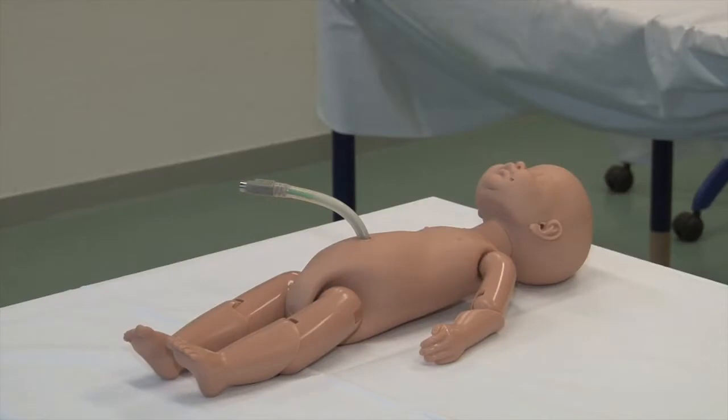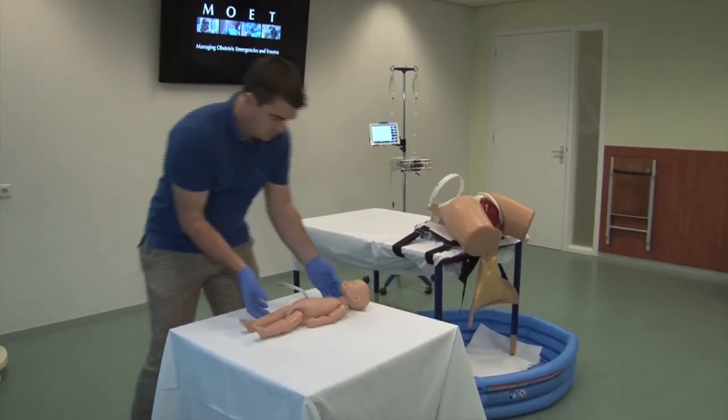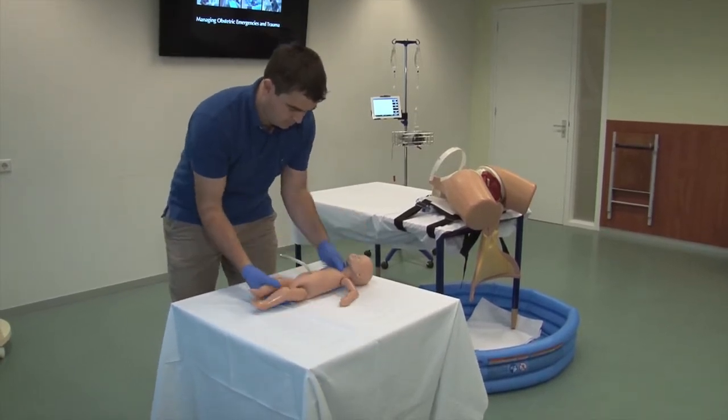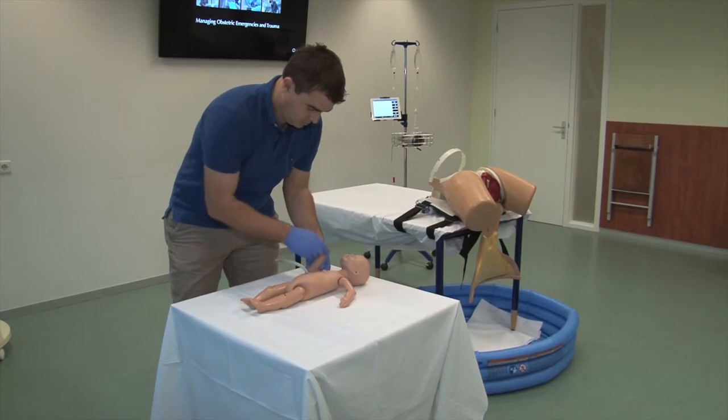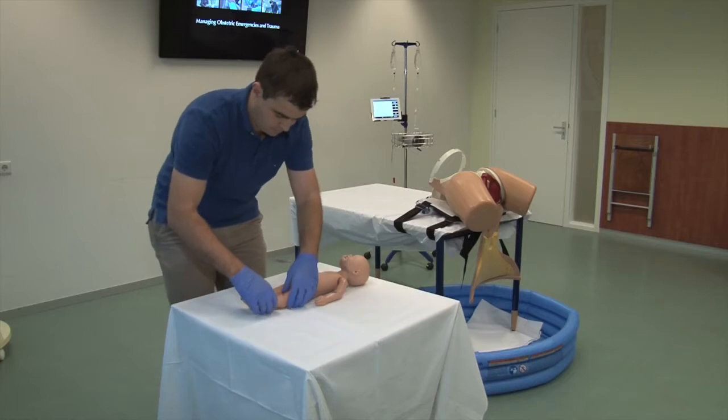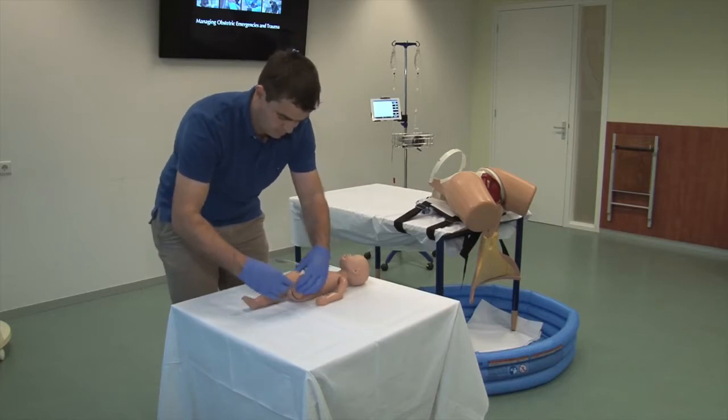The fetal manikin is of an approximate size and weight of a term neonate. It is important for the fetal manikin to have flexible joints in the shoulders, elbows, hips and knees, in order to realistically mimic the real-life manipulations that come with breech extraction.